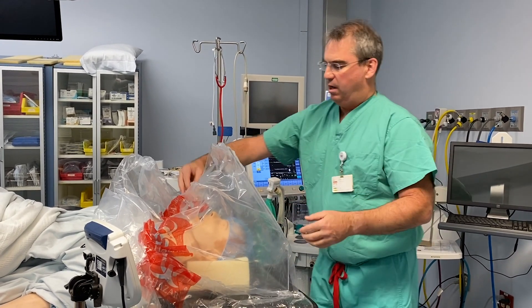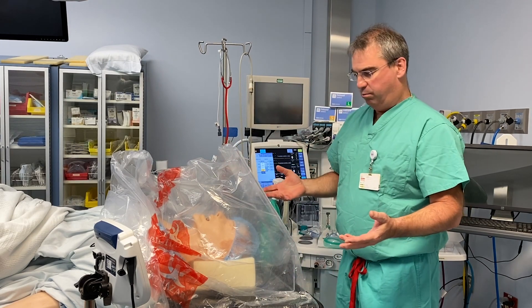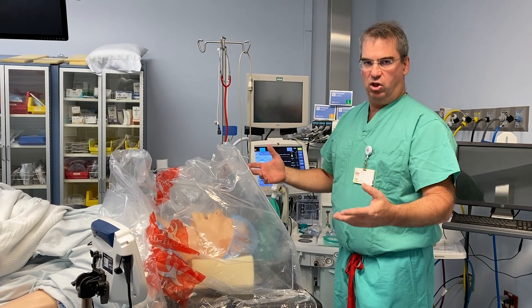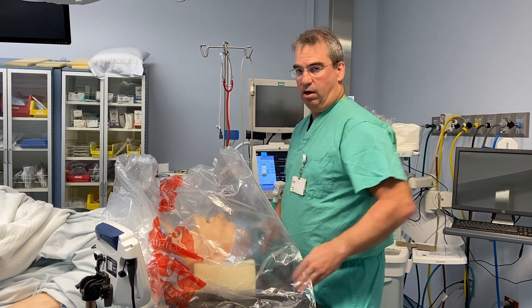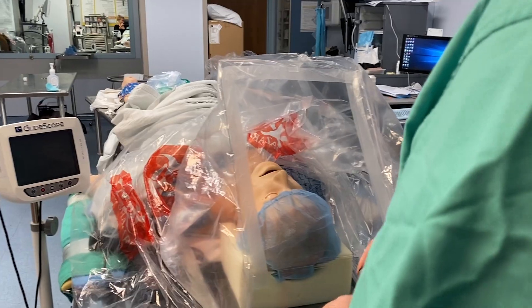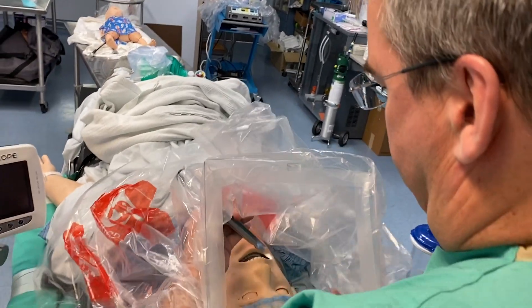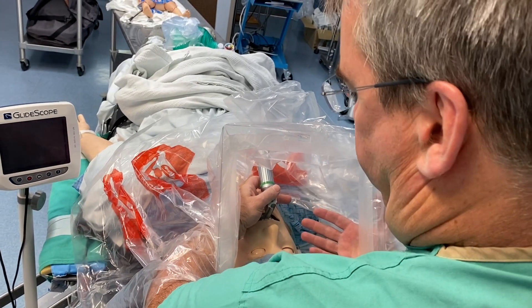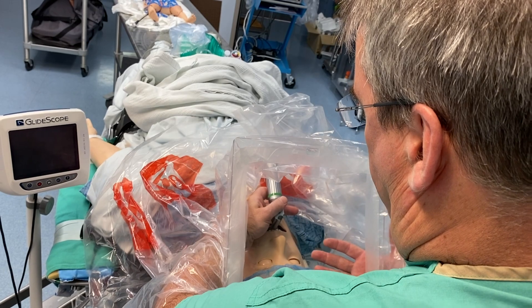Now we have a nice little environment for them to be able to breathe and exhale or cough without creating droplets all over the operator room. I can then reach in here in full PPE and manage the airway without any difficulties. This is the clarity of the view — the view is very good. One can do direct laryngoscopy in here without any difficulty at all. The visual field is very good and the visual acuity through the screen is excellent.